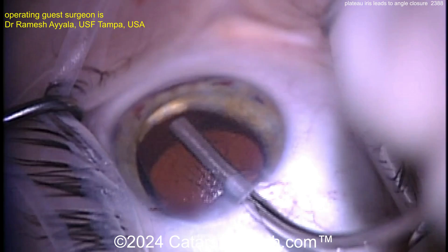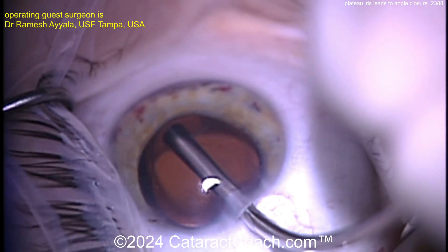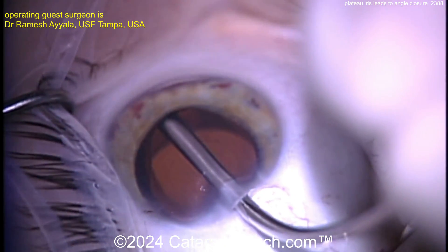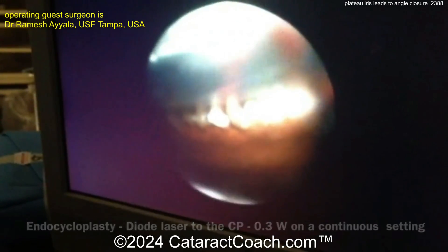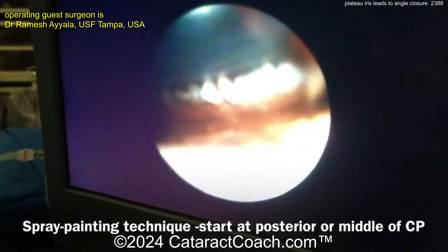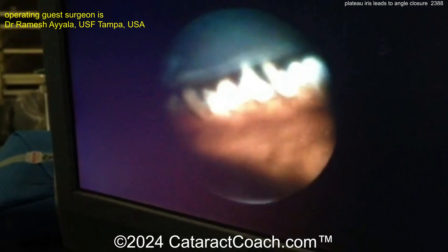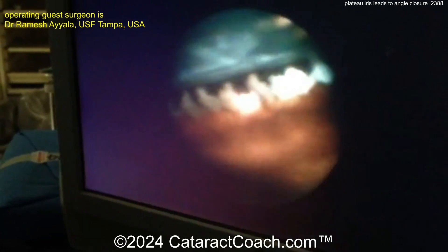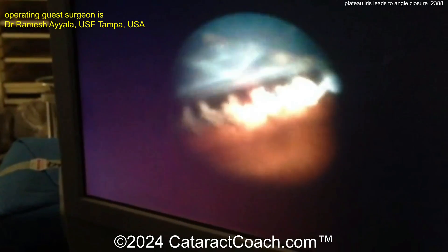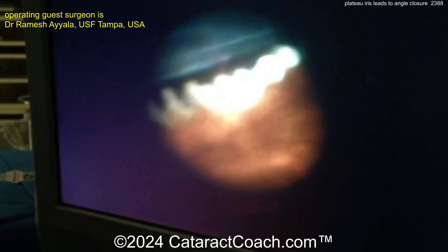Now painting the ciliary processes to shrink them, and also in the valleys — not just the processes — to help reduce the IOP. He's going to do this for about 150 degrees of the nasal ciliary process. Here, delivering that laser energy — this is a video taken of the ECP monitor.